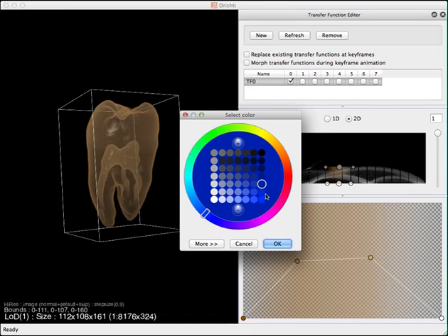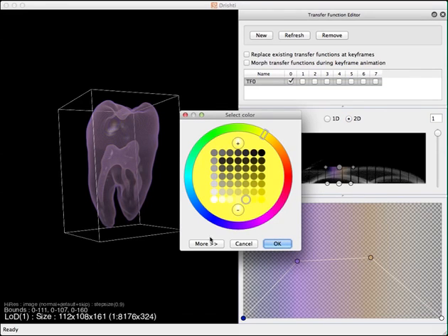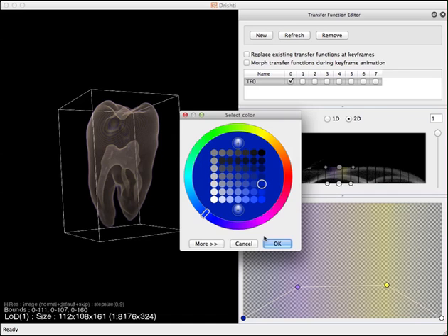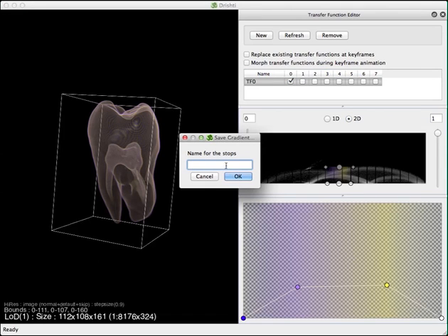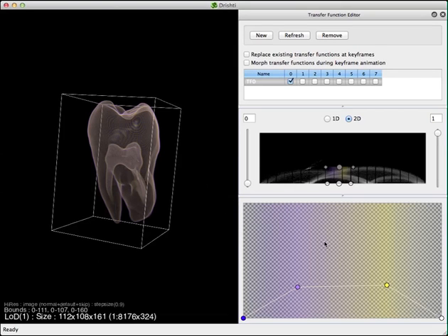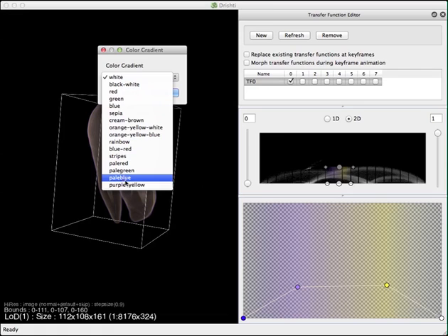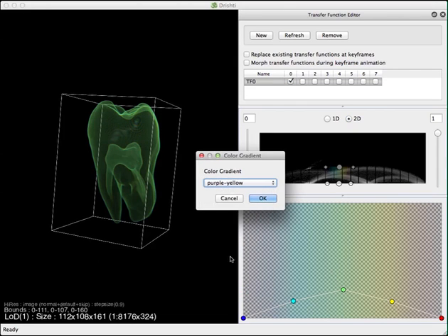Suppose you have selected a color range you like — for example, blue, some color, another color, and white. To save this, hover over your color-opacity widget and press S. It will ask you for a name; let's say 'purple yellow' and then save. Next time, press the spacebar here and you'll get the saved color gradient. For example, if you have a rainbow color setting, press spacebar and you'll get your saved purple color. This is how you save and retrieve color information.